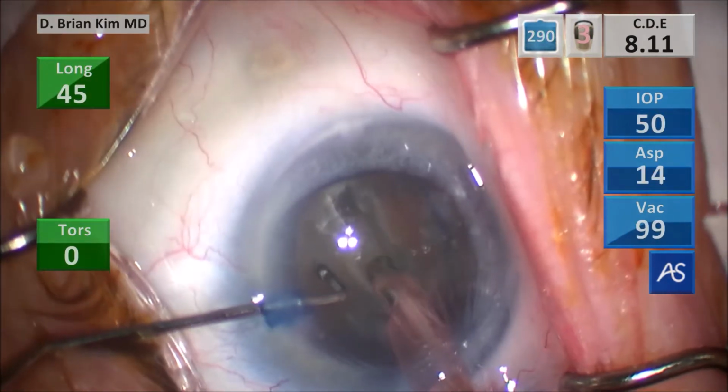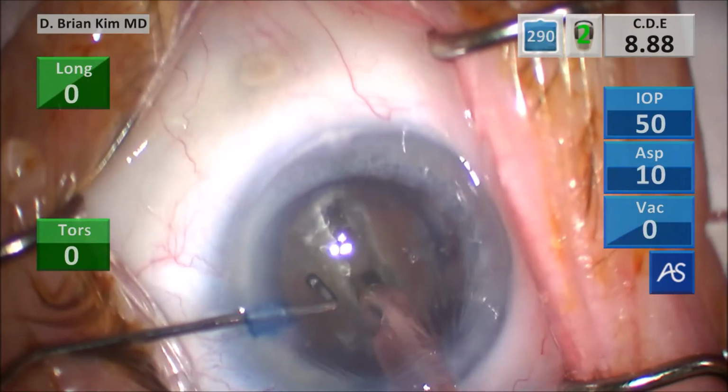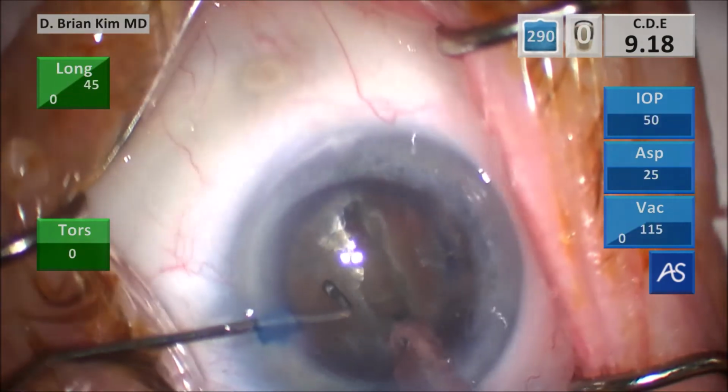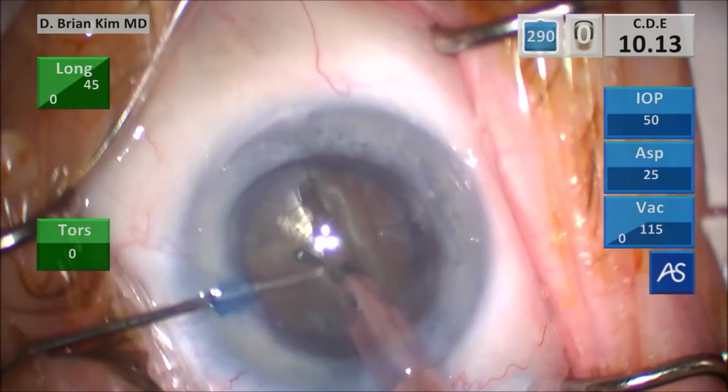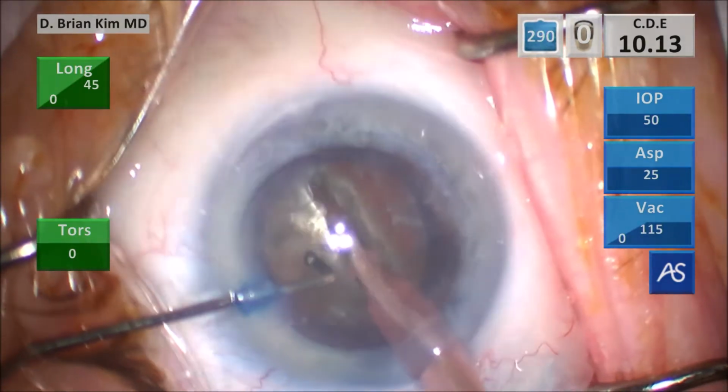And you can see, look at the CDE, it's going up crazy. And that's because I have to use a lot of ultrasonic energy, in particular longitudinal in this case. I'm turning bevel up now. I feel like it's deep enough.